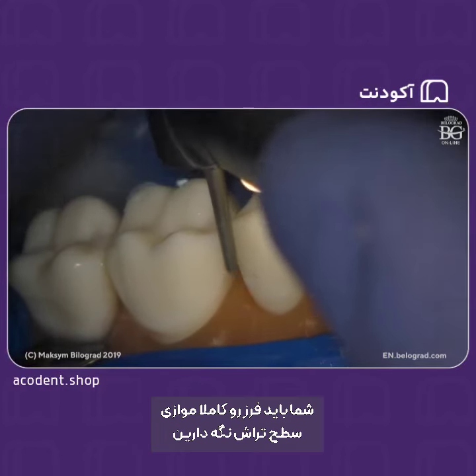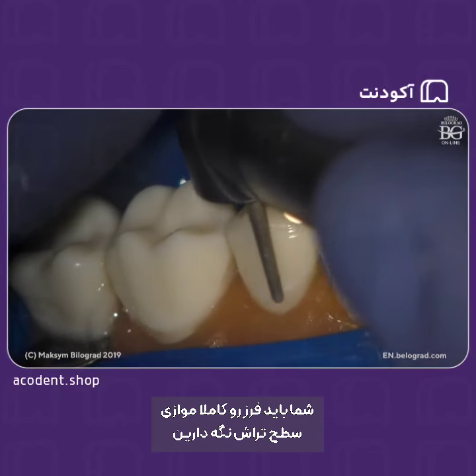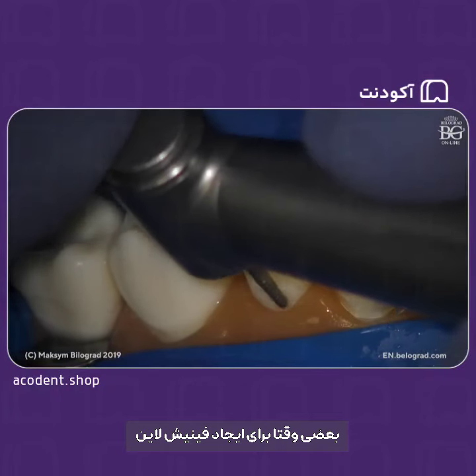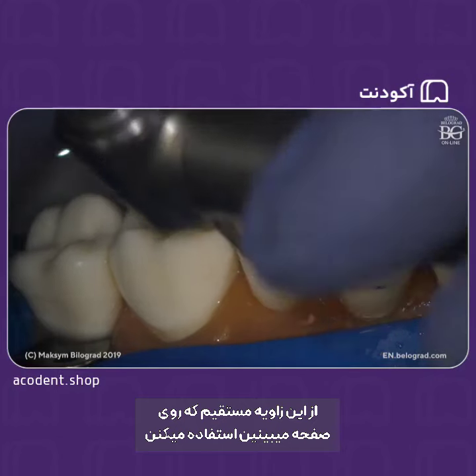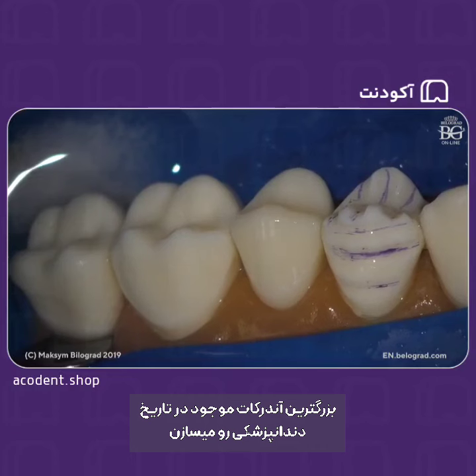So you have to keep your burr really parallel to the surface that you prep, because sometimes trying to make the finish line, people make a straight angle like you see on the screen, but it will be a mistake, because within a few seconds you will get the hugest undercut in the history of dentistry.